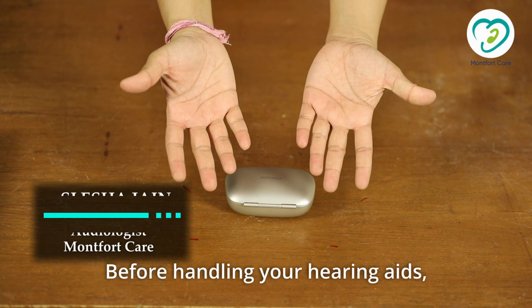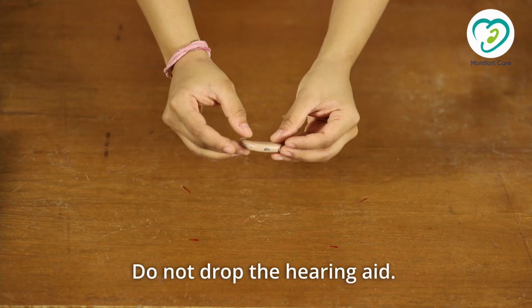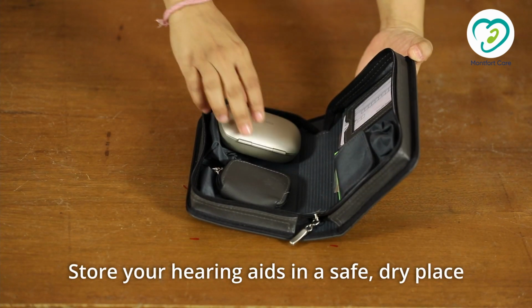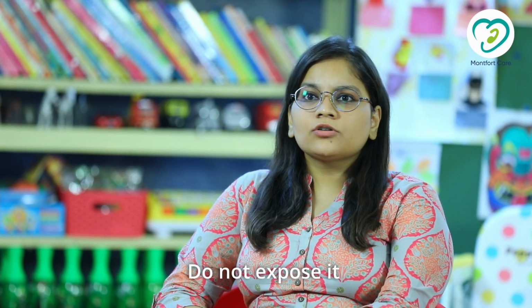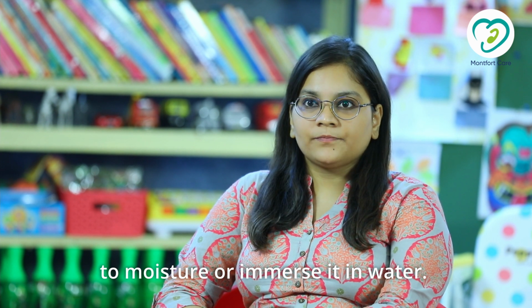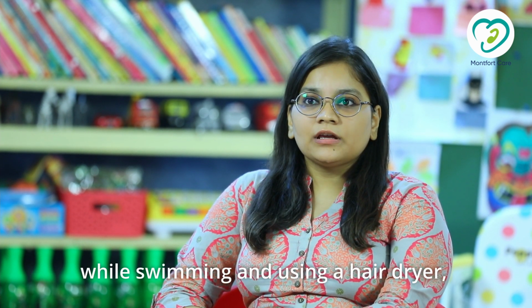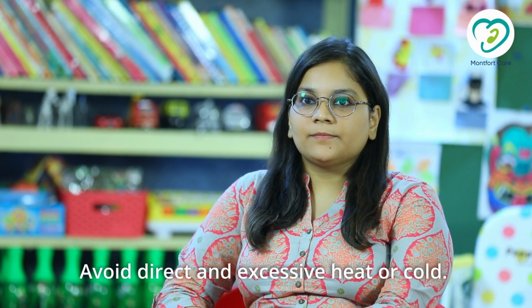Care and maintenance of hearing aids. Before handling your hearing aids, make sure that your hands are clean. Do not drop the hearing aid. Store your hearing aids in a safe, dry place away from children and pets. Do not expose your hearing aid to moisture or immerse it in water. Don't wear your hearing aid in the shower, while swimming, and using a hairdryer, hairspray, or other types of spray.